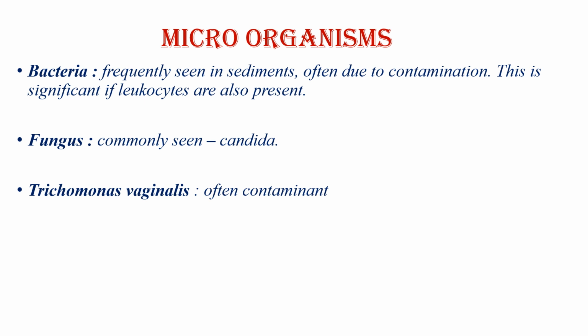The final component of microscopy is microorganisms. Bacteria are frequently seen in sediments, which is often due to contamination. This is significant if leukocytes are also present. Fungus is commonly seen, Candida, which is normal flora. Trichomonas vaginalis is often a contaminant.